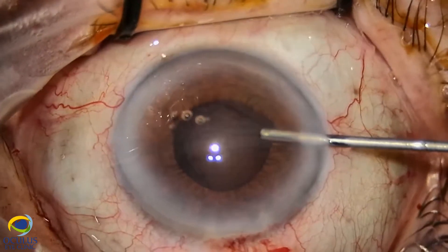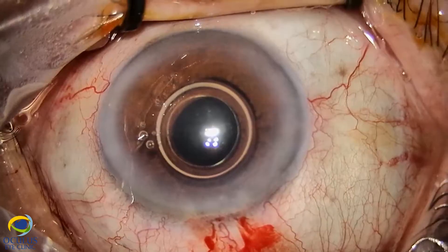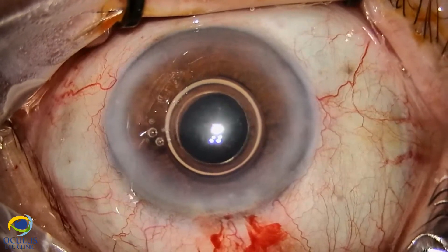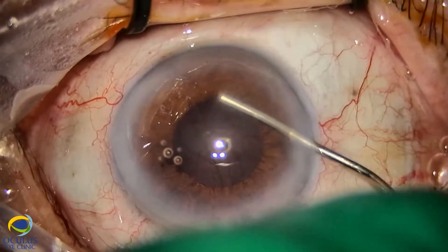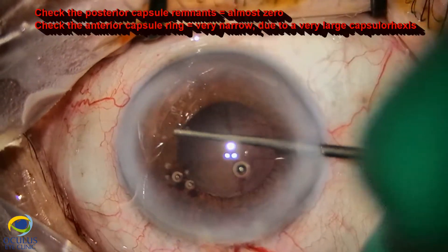We completed the anterior vitrectomy again in the pupillary area and in the space behind the iris. Meanwhile, the pupil constricted quite significantly. With OVD, we managed to enlarge it and to visualize the posterior capsule better.